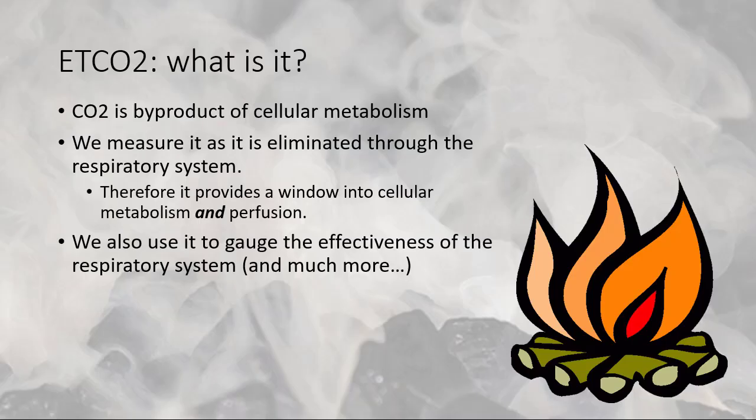So as we talked about already, CO2 is the byproduct of cellular metabolism. That's how it gets into the bloodstream and then gets into the alveoli. But end-tidal CO2 is when it gets in the alveoli and it's washed out through ventilation, mechanical ventilation, we measure it. We measure it at the very end of that cycle when it should be, in theory, the highest point before we take a breath in.